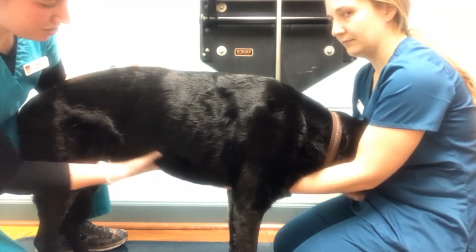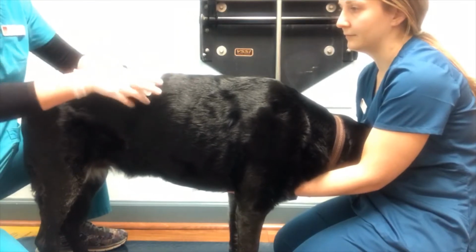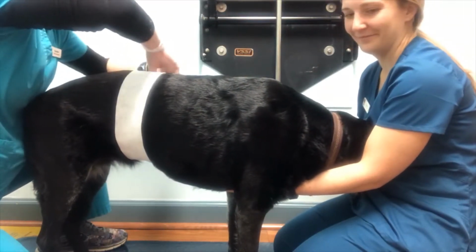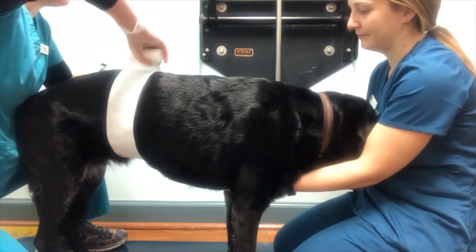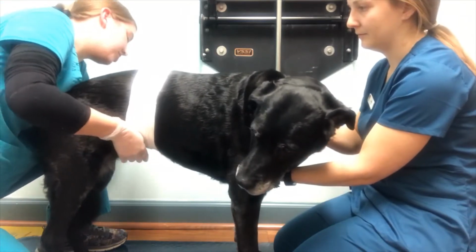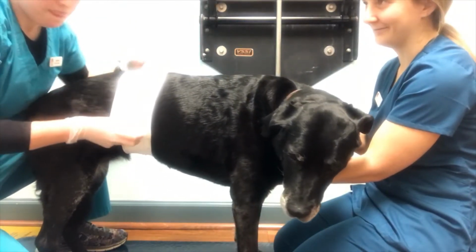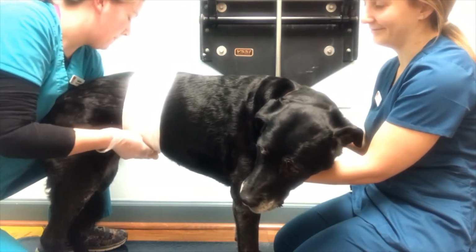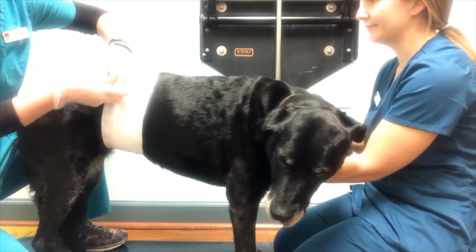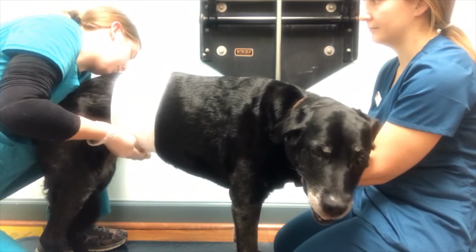So for this, I'm kind of just going more abdominal. I'm going to start with the cast padding. Definitely going to need some more rolls. And for this one here, versus a leg wrap, you want to make it snug in this case. Still going to have overlap about 50%, and pulling this one much more snug than you would a regular leg bandage, till you can get that even pressure.